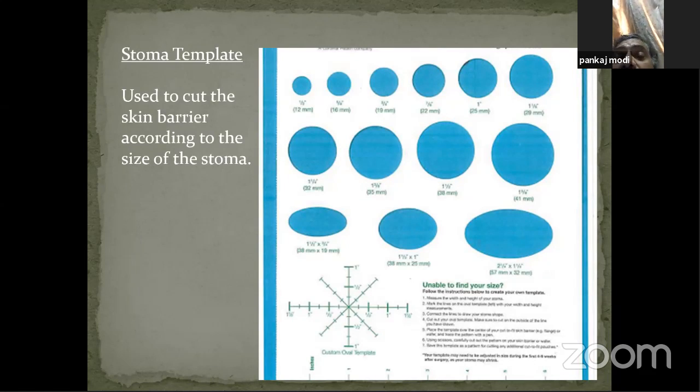That when a stoma is created, you should immediately try to apply the stoma bag. Learn this one thing and it will be useful. Because most of the time we have a habit of saying, what is it, just put some gauze on it.